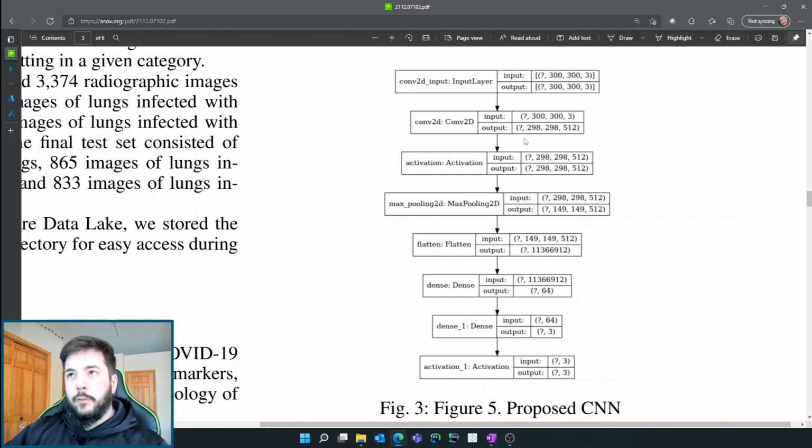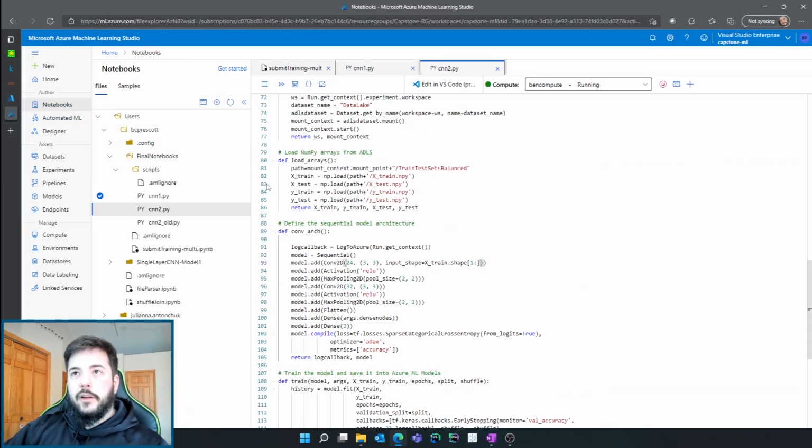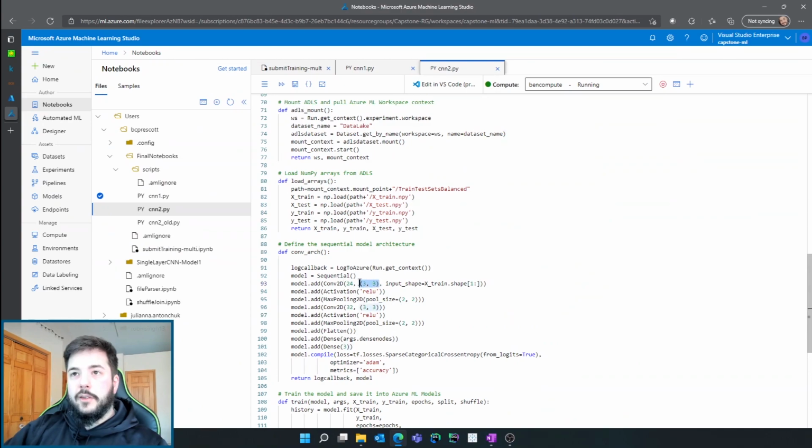Kind of what happens at a high level is every time you create what's called a feature map, it uses one of those filters. Remember, we define the number of filters to use. You can think of the input image as a matrix of numbers. The filter is also a matrix of numbers that is smaller. In the case of what we define in our network, our filter size is 3 by 3, so it's a 3 by 3 matrix of numeric values.